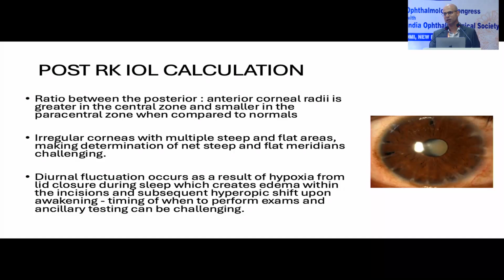In general, in myopic errors, I always try to go with the highest IOL power that is available, unless it's a very big outlier. So always err on the side of more myopia, and it's okay to end up with myopia rather than hyperopia in these post myopic refractive surgery eyes.